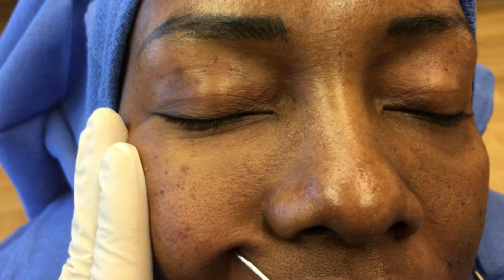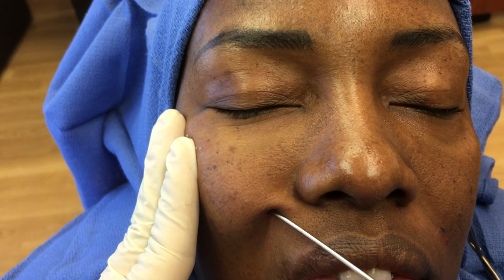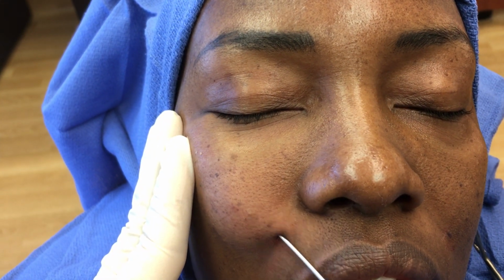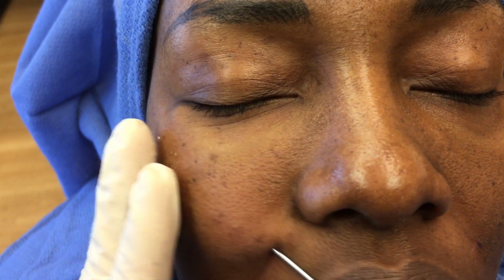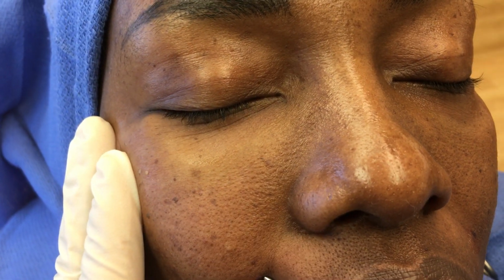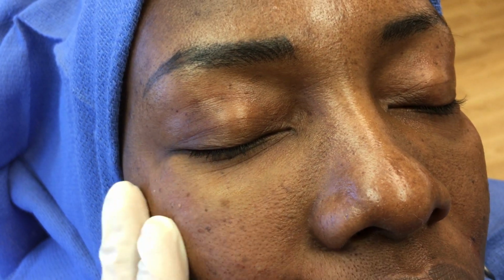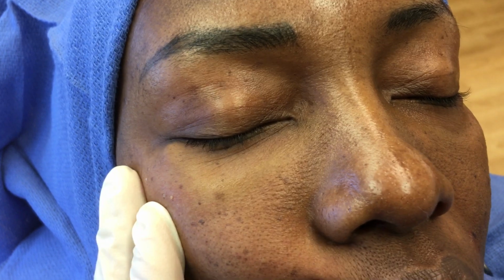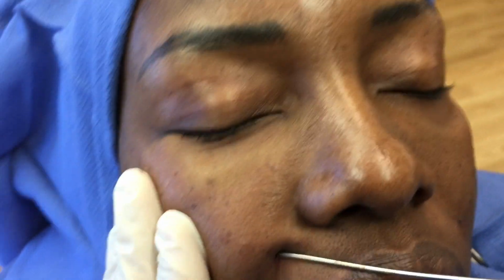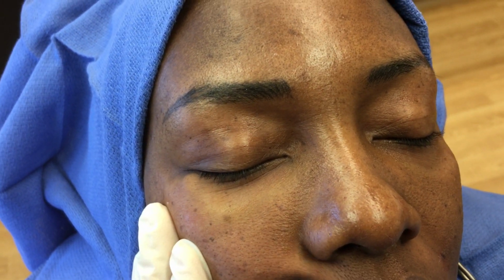One thing about fat, unlike Juvederm or other off-the-shelf products, is that it does require a larger needle like this, but as you can see, she's pretty numb. But also it causes a little bit more trauma to the tissue, and because of that there's a lot more swelling. So what you'll see after we're done is she's actually going to be quite swollen, so I don't want you guys to think that she's going to stay this big, because she won't. She's going to wind up maybe 3 times bigger than she will be, and that'll go down within the course of about a week.